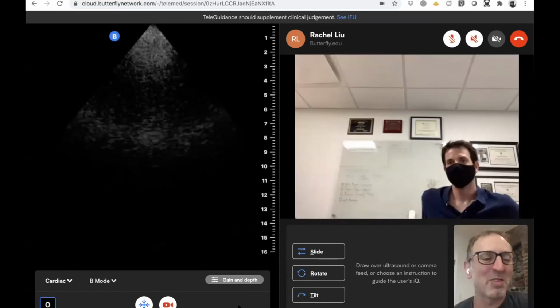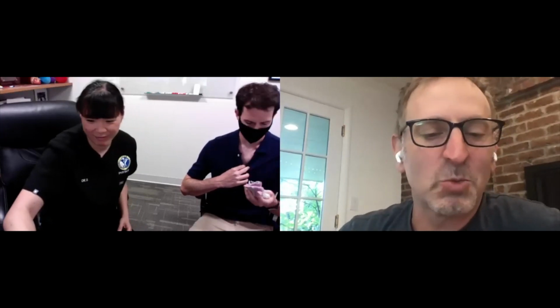Well, thanks for the thyroid demo. I think we should definitely set up a teleguidance session with more live scanning. This session was really set up for image review, which I think we got through surprisingly a lot. The one thing I would say about the thyroid study that did pop up in the Q&A is why MSK versus small organ. You could absolutely do it in small organ. That's fine. We can set up a time for some more live scanning, but I'm really happy we got through as much image review and tips as we did.